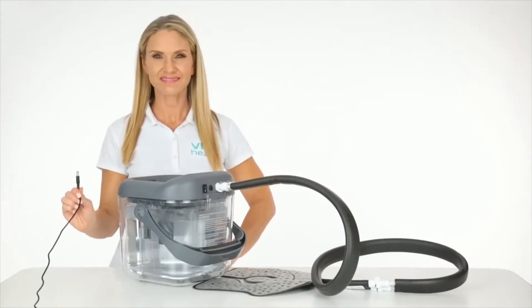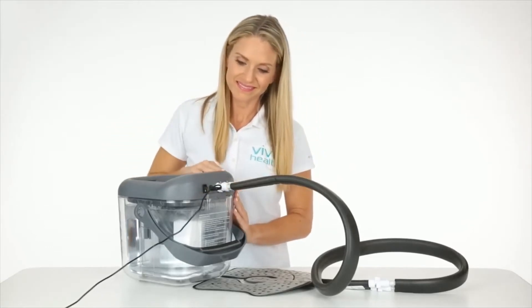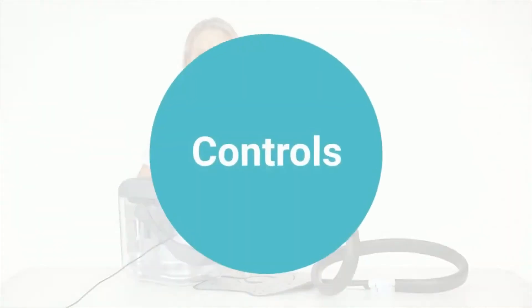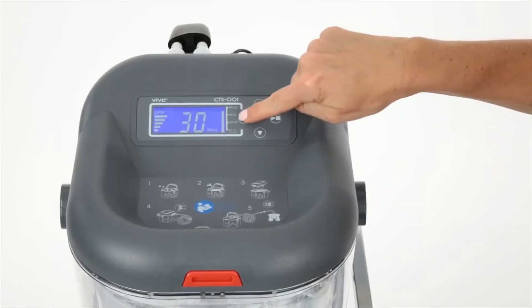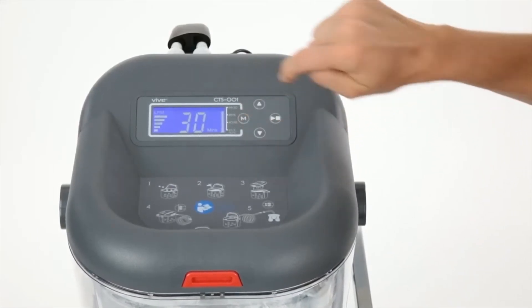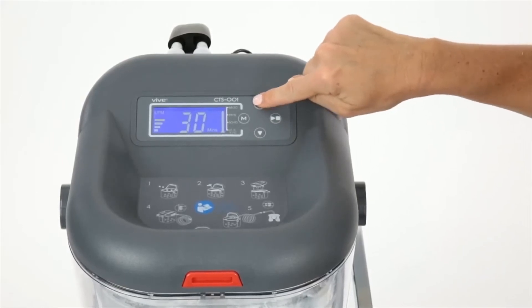To power the device, plug the power cord into the lid. To turn the unit on, flip the switch next to the power plug. To change the liters per minute, press and hold the M button. As the letters LPM flash, use the arrows to decrease or increase the flow of cold water.